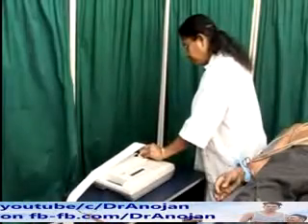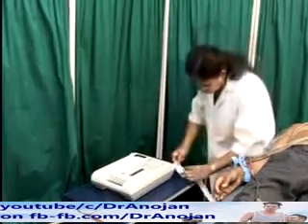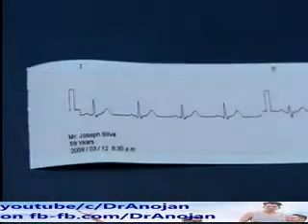At the end of recording of the ECG, write the patient's name, age, date and time of recording on the ECG.